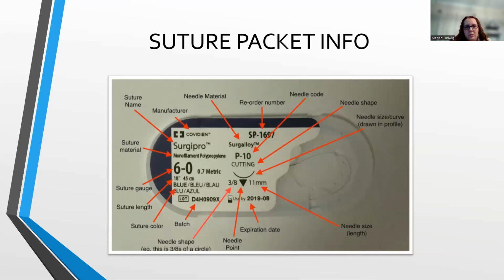It might break apart easier. Yeah, integrity, that's the word. Integrity of the strand can't be verified. So if you put this in an incision and it's expired, there's a very good chance it won't hold up. It might break. So always pay attention to that.